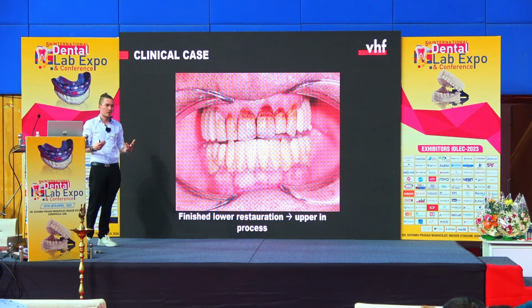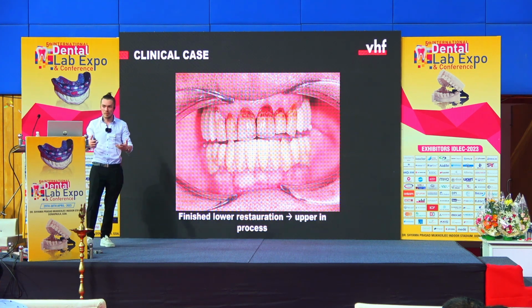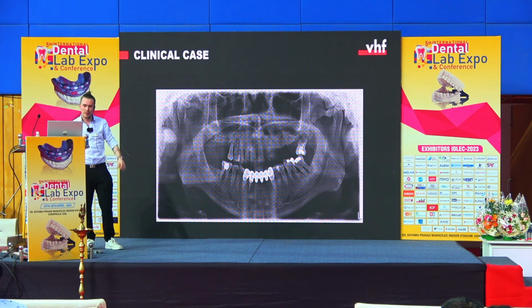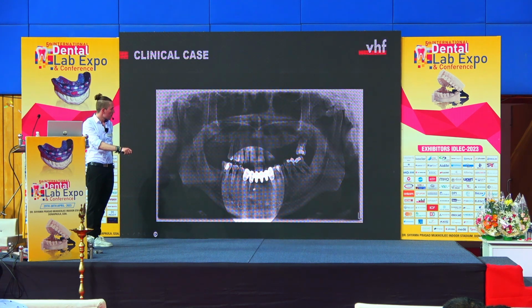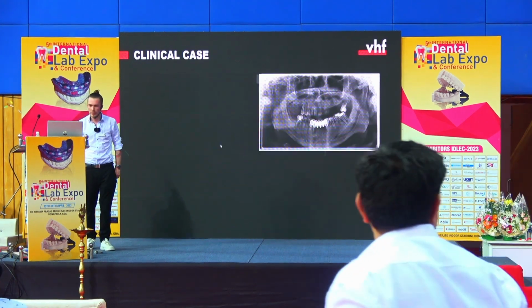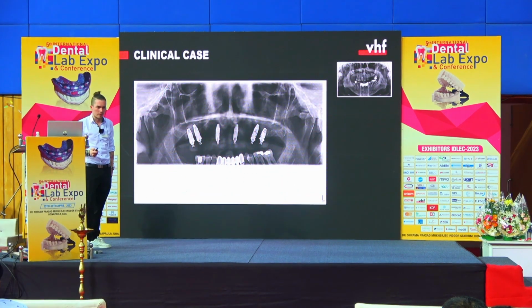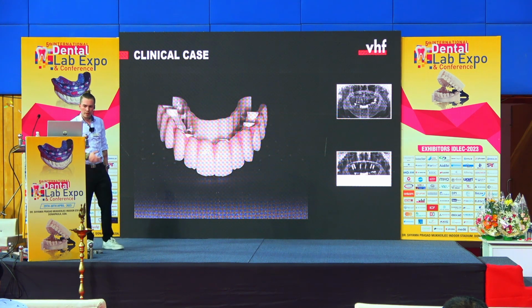Unfortunately, because this case is really new, right now we're working on the upper jaw, so I cannot provide you with any final pictures of the upper restoration as well. But I also have here this case from the upper jaw, so we had some kind of restorations in the lower one, and a little bit of rest tooth in the upper. They have all been extracted, and the implants have been set. And here again we have the restoration.